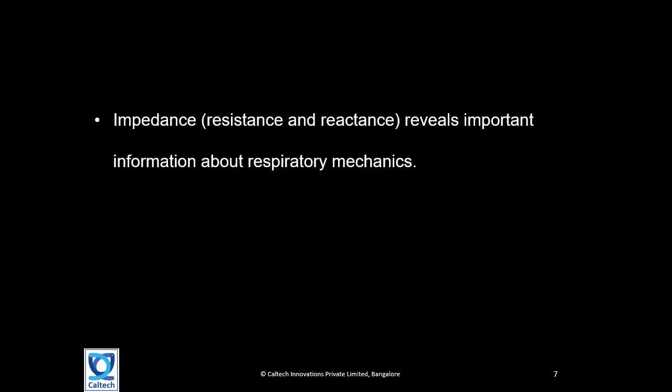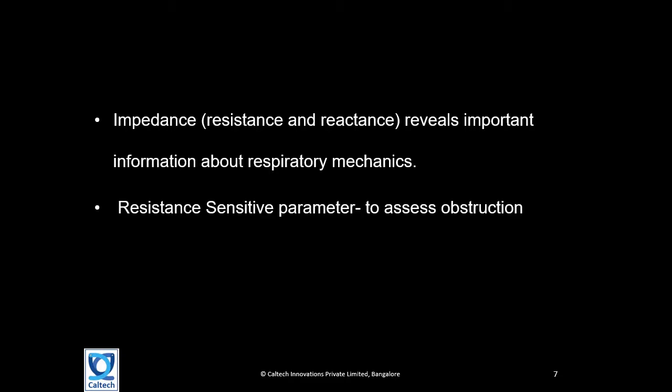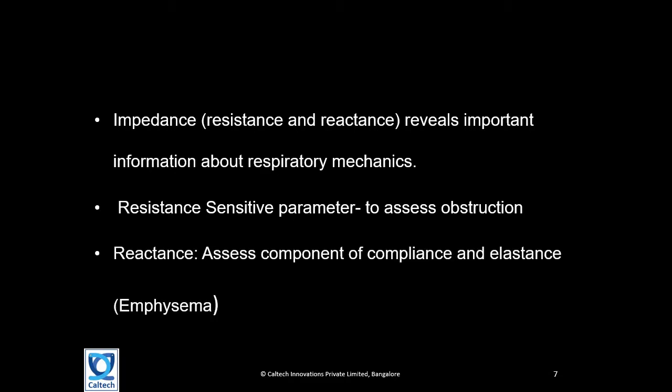As we spoke, impedance is the sum of resistance and reactance, and it reveals important information about respiratory mechanics. Resistance is a very sensitive parameter to assess obstruction, while reactance is a parameter to assess components of compliance and elastance.